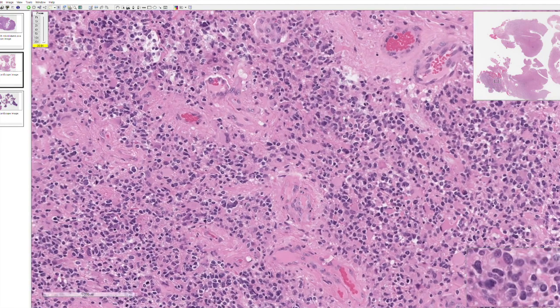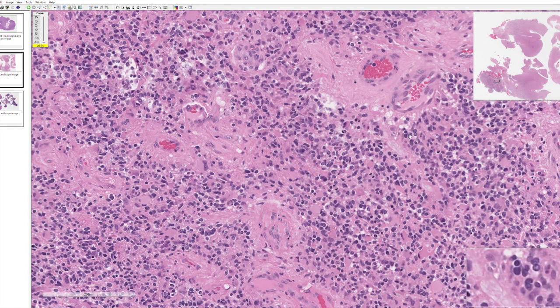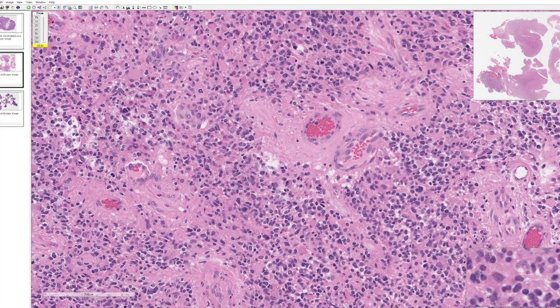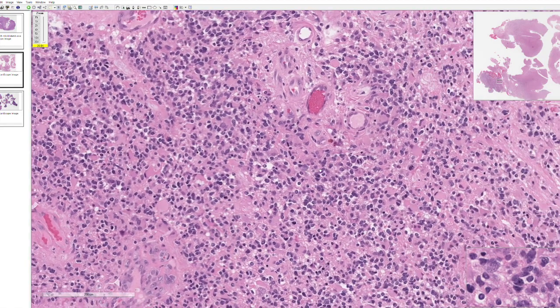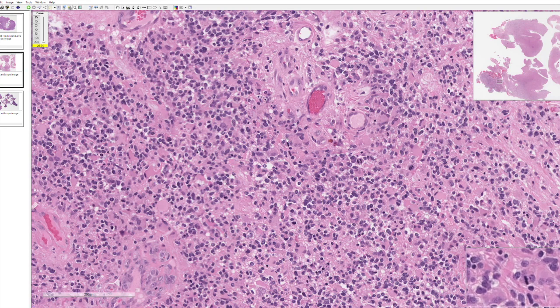And if we hunt around closely, what we find is that we can look for cells that are actively dividing. Oh, and here we see some here. We see some cells where the chromosomes are in fact condensed.